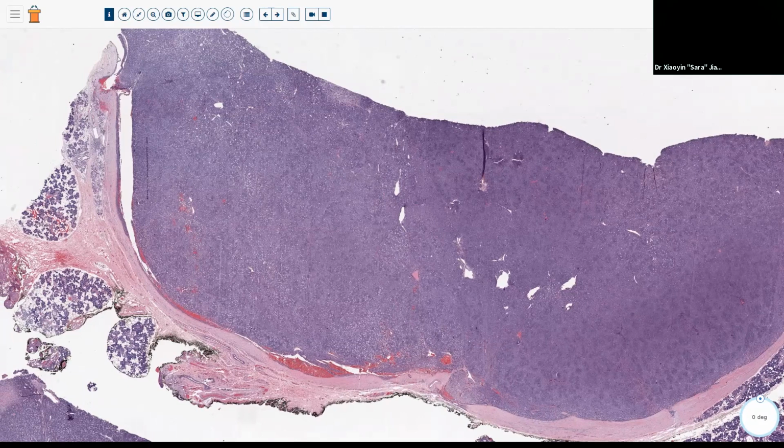You can do some IHCs. You can get CD117 positivity. These are going to be P40 and P63 positive peripherally, and have nuclear beta-catenin. Honestly, in my practice, I don't do a ton of IHCs on these. It's kind of a morphologic diagnosis. All right, so basal cell adenoma.